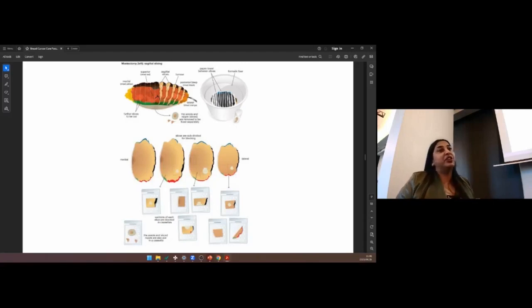So if there is a history of neoadjuvant therapy and the registrar is not able to find the tumor, it is very, very helpful to go back to the mammogram, identify which quadrant the tumor was in, and then look for the tumor bed, because we have to identify tumor bed to make sure that there was actually a response to neoadjuvant therapy. So the mammogram actually helps us quite a lot, especially if we're not able to x-ray the breast, because that's also what we can do. We can set it off for x-ray. But it's probably easier and more resourceful to look at the mammogram and work out what's the area you should concentrate on sampling.